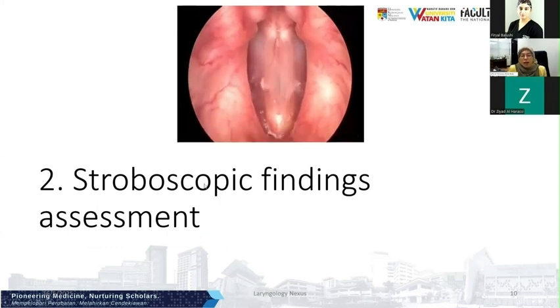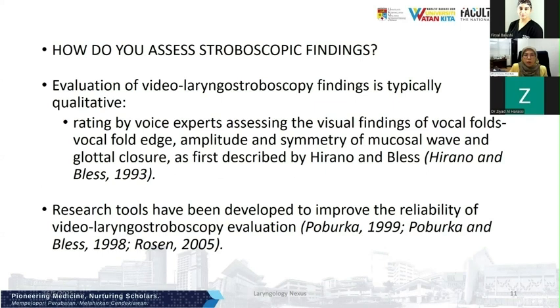So now, when you see that, the question is, how would you document it in your medical record? How can you share the findings with your colleagues, with other ENT surgeons or maybe laryngologists? So there must be ways to assess the stroboscopic findings and document them.